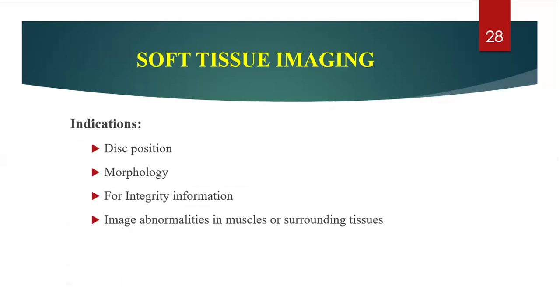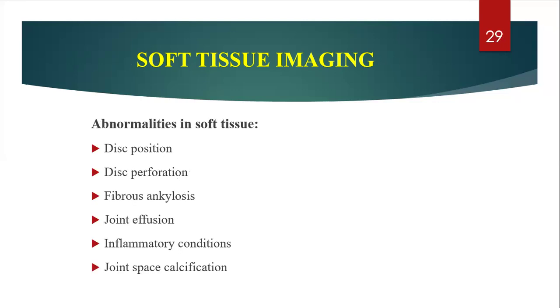So moving on to soft tissue imaging. Indications of soft tissue imaging include any condition which affects the intra-articular disc. Indications include disc position, disc morphology, integrity information, and also for the soft tissue, that is, the muscles which are surrounding the temporomandibular joint.